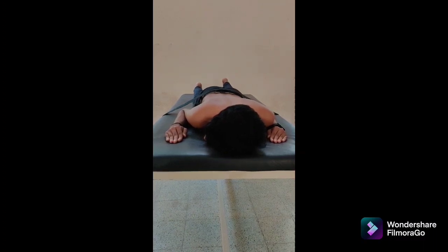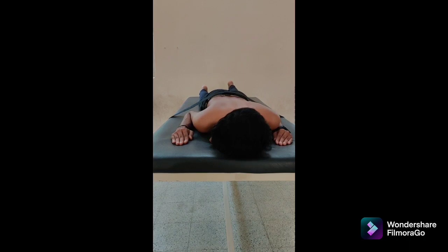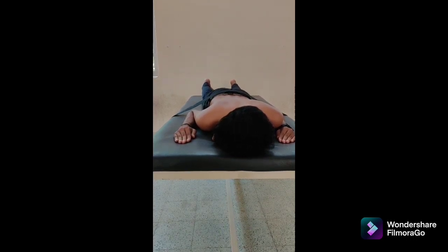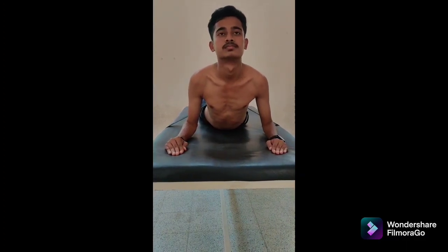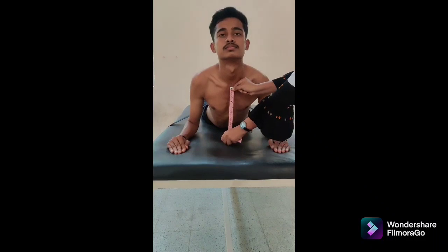Third method is prone push-up. Patient position: lie on the stomach on a plinth with palms of the hands positioned at shoulder level. Place a belt over the pelvis to prevent it from lifting off the supporting surface. Tape alignment: measure the distance from the sternal notch to the supporting surface; tape measure is vertical. Record the measurement. Instruction: extend elbows to raise the trunk off the table and extend the thoracolumbar spine. At the end of the motion, measure the distance between the sternal notch and supporting surface.